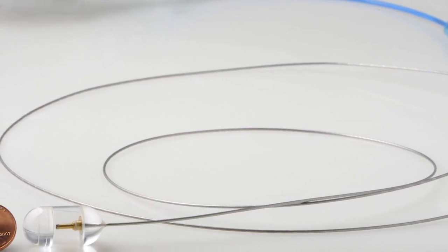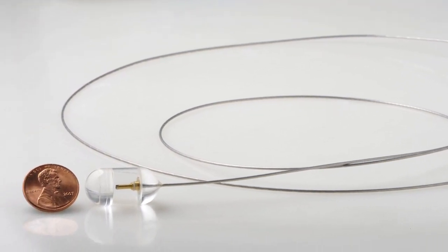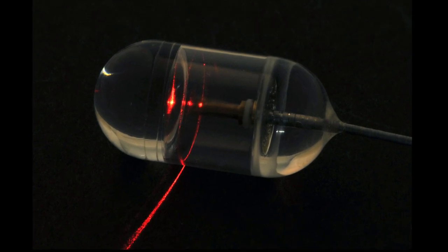Researchers at the Massachusetts General Hospital in Boston have invented an ingestible, tethered endoscope that will allow doctors to image a patient's esophagus without sedation.